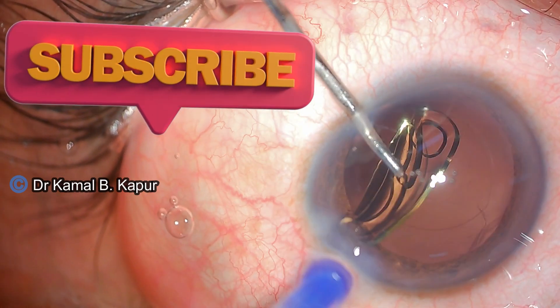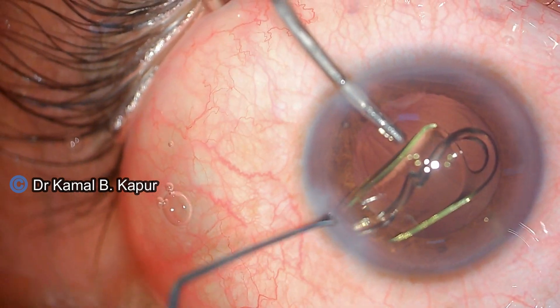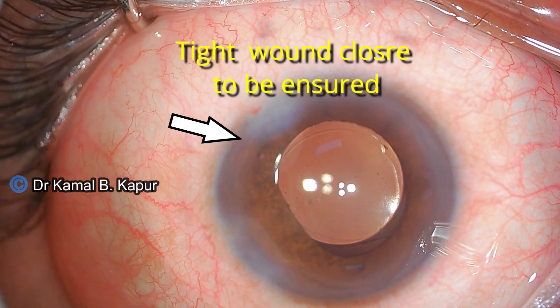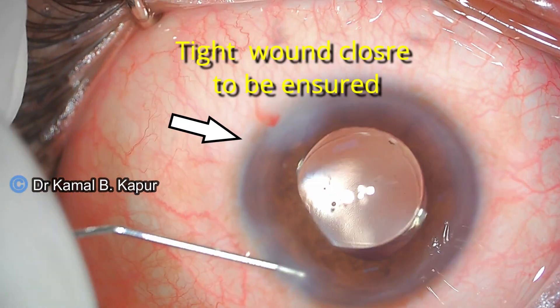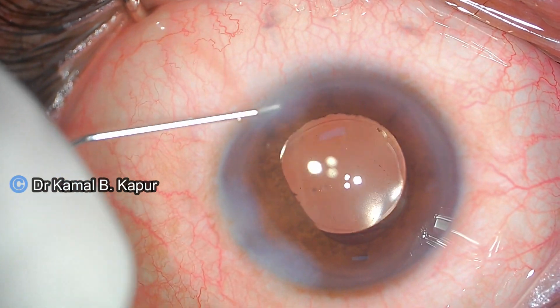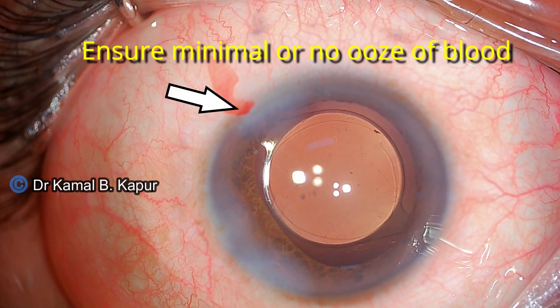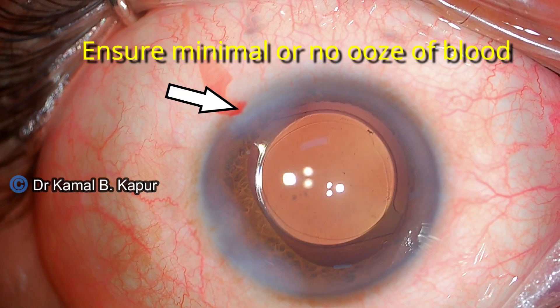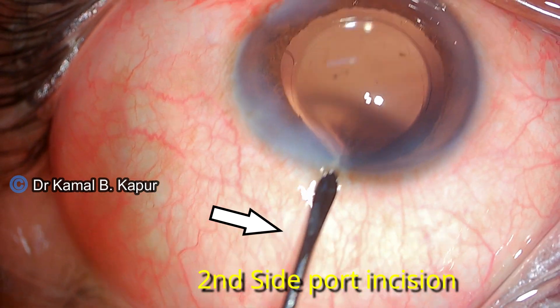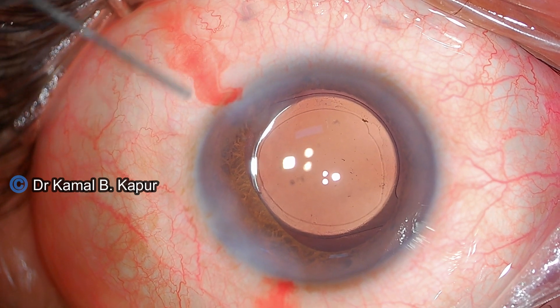We proceed to implant the IOL inside the eye. Once the lens is implanted, we make sure that the wound is very tight and watertight, because we don't want any shallowing of the anterior chamber when we put our gonio lens and apply pressure on the eye to rotate it in the opposite direction.